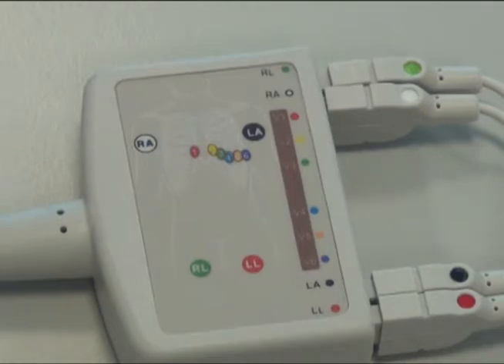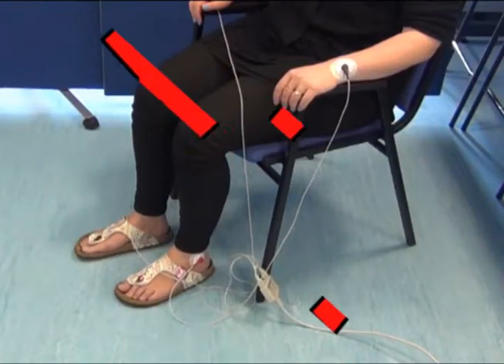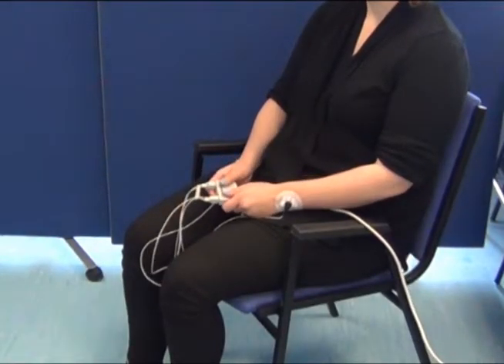There are different conventions with regards to wire colours and placement on the body — for example, differences between the US and Europe. Always check the correct wire placement for the equipment you are using. In order to avoid tripping and equipment damage, and to ensure that the recorded signal is clean and reproducible, make sure the wire connector is not lying on the floor. Instead, you should ask the patient to hold it.